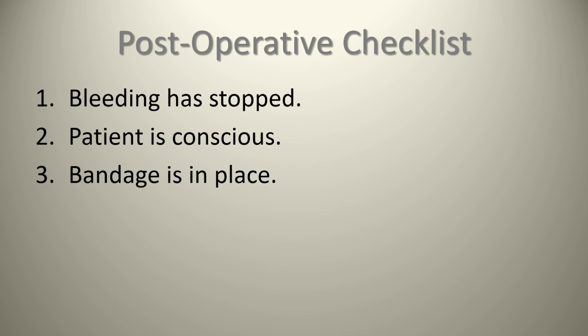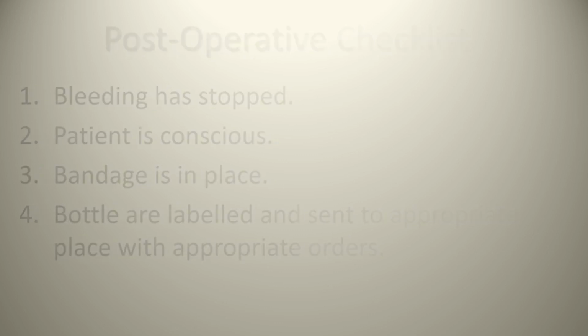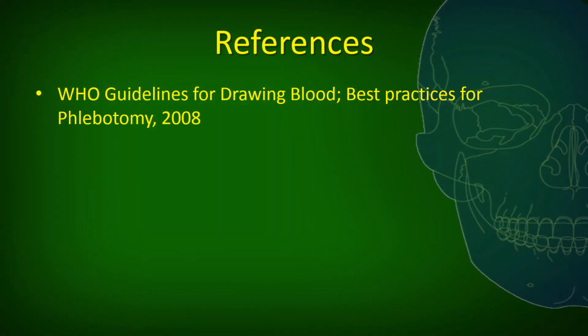It is conventional practice to take the bottles, which are labeled, and then apply the alcohol sanitizer, and apply pressure with an alcohol wipe. Take the phlebotomy needle and secure it using the safety needle reference here that we have. Pop the tourniquet off, and my assistant will take over in terms of presentation, applying pressure guidelines for the bandage on me. I'm going to take these bottles.